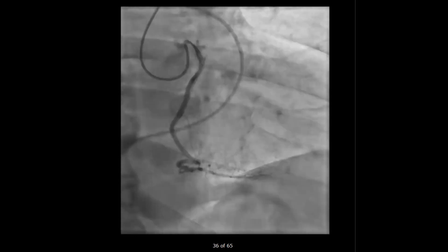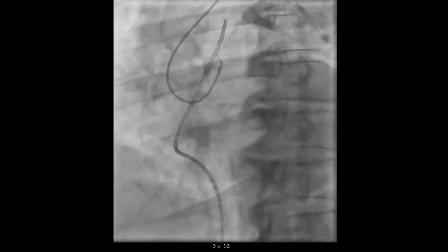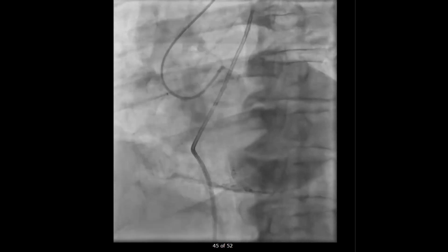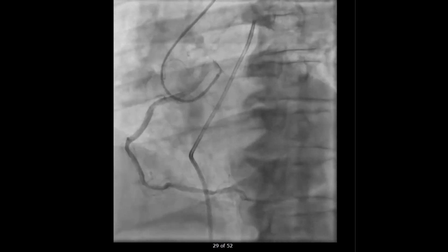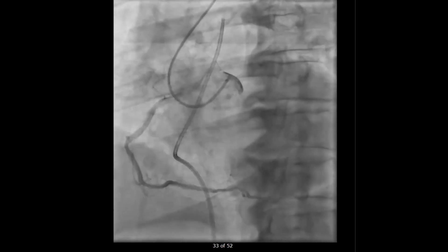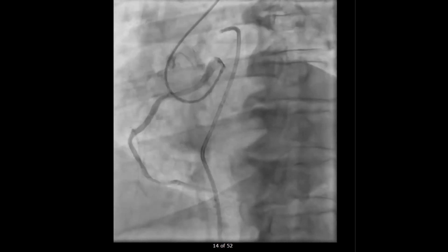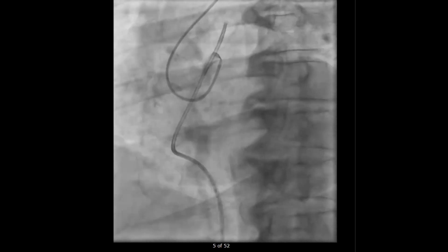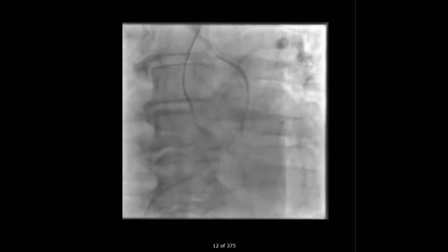This patient came in with syncope, which creates a challenging dilemma because there's syncope and he has severe AS. On echo, because of the angulation of his aorta, the mean gradient was in the 20s. See how unsteady it is? The other option to deal with this is to put a wire through it and park the wire inside — what we call air-mailing. While floating in the blood with a jet of aortic stenosis shooting up, you try to get a wire in there, park it in, and then that wire gives you the support.